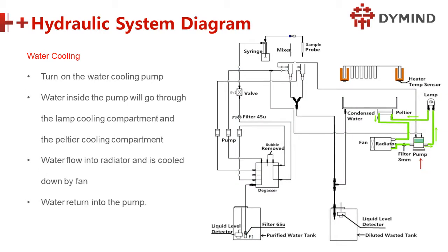Next is the water cooling system. Do you still remember the purpose? Why do we have to do the water cooling?